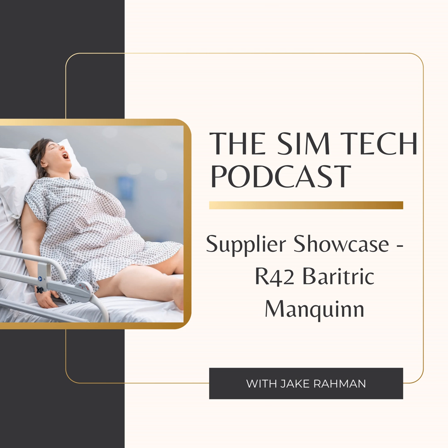The other thing that is being done as well, for instance, the 3D print designs of the teeth, Rib Productions are quite happy to give them away. So you can print your own teeth, you can make your own, you can change them if you want to. Little things like that, as time goes on, are going to become more and more apparent. And the idea is so she becomes self-sufficient over time with regard to repairs.